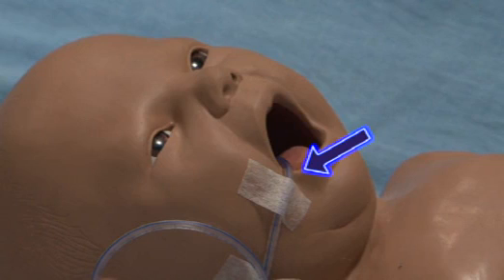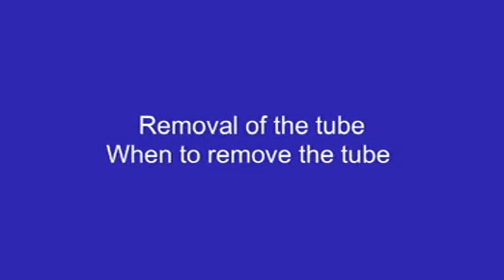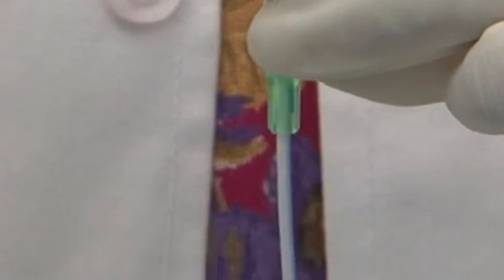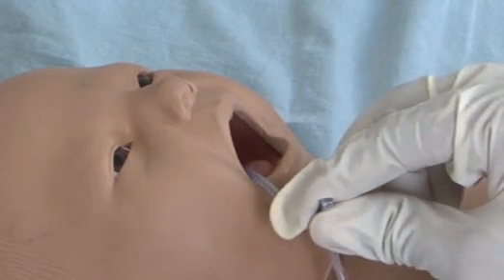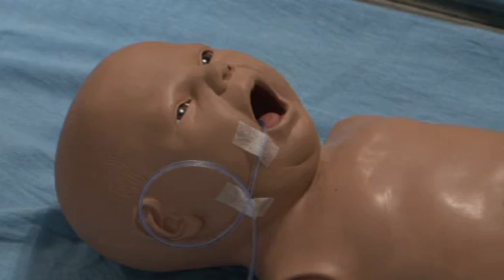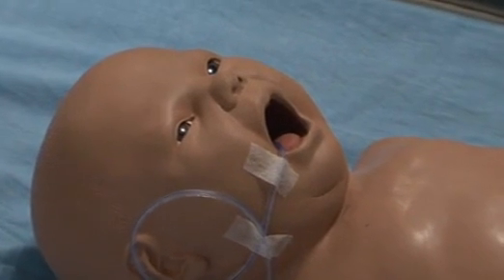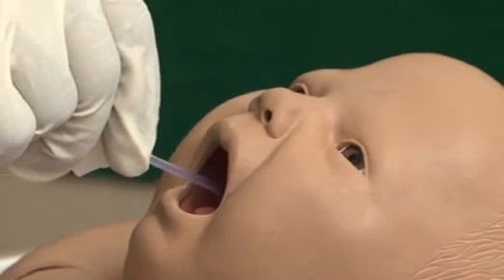Record the point of insertion of the tube in centimeters at the angle of the mouth before each feed. Removal of the tube: remove when the tube is blocked, or when there is improvement in the baby's condition. If required to keep the tube for a longer period, replace with a new tube after 3 days.